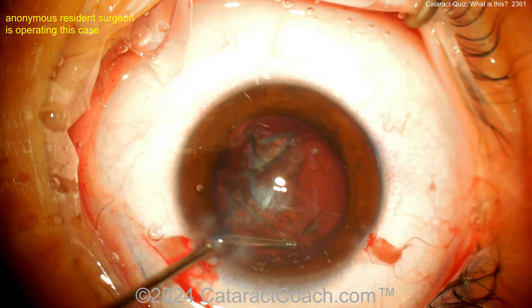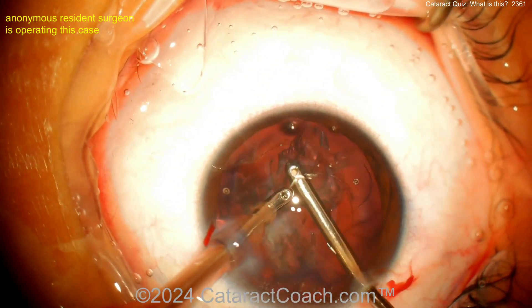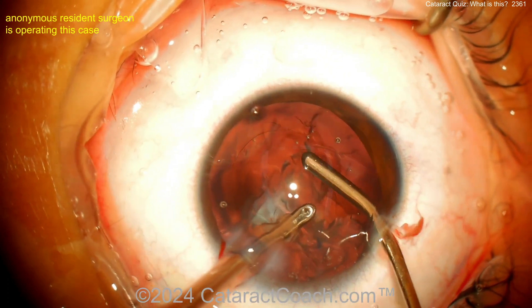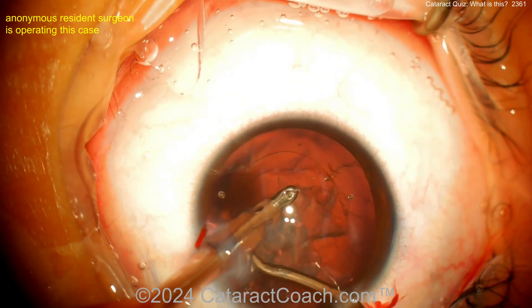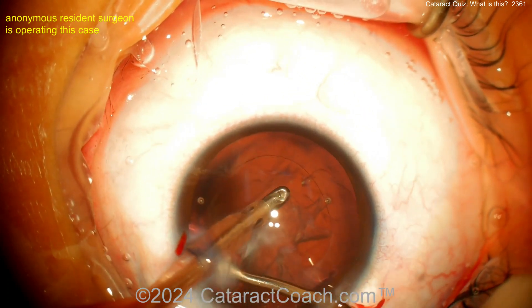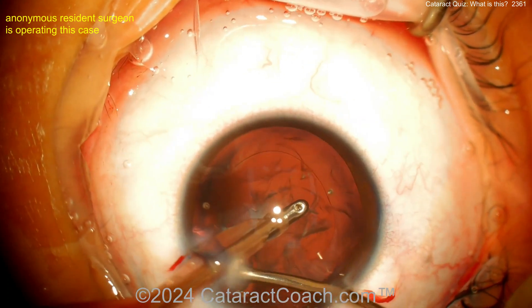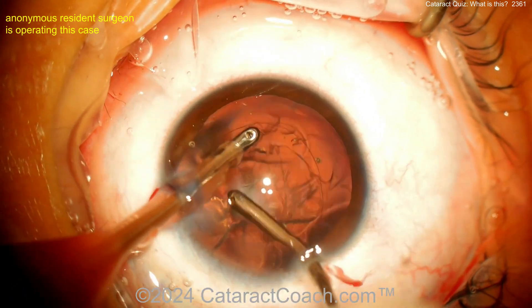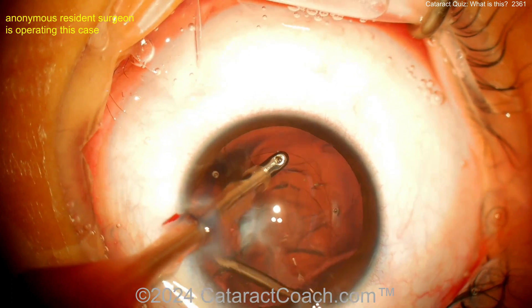Going in with a bimanual approach — viscoelastic dissection. Irrigation with the left hand, the right hand is the aspirator, cleaning that up. But looking back there — have you figured this out yet? This is our quiz. Here are a few hints: young patient, has had this since birth, almost always unilateral. Look carefully — this is persistent fetal vasculature syndrome.